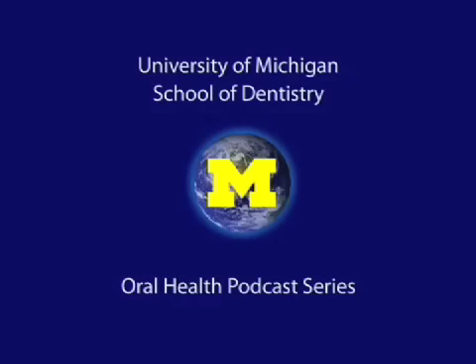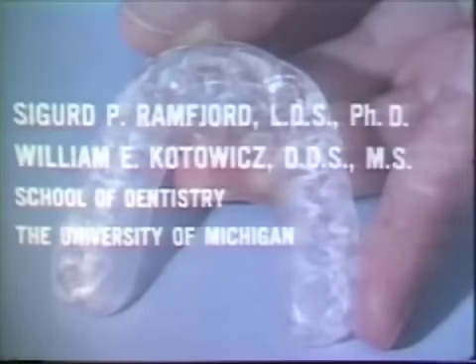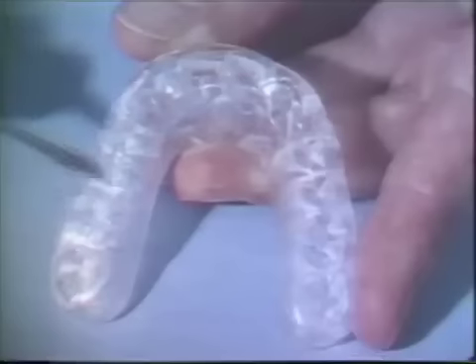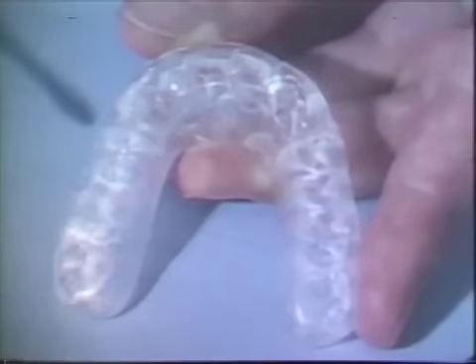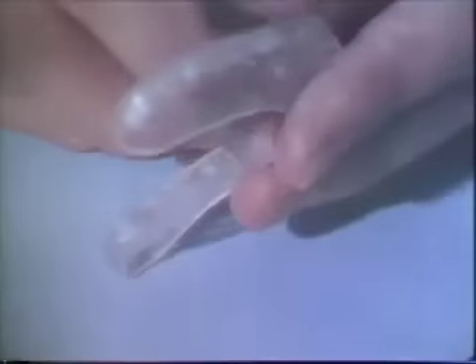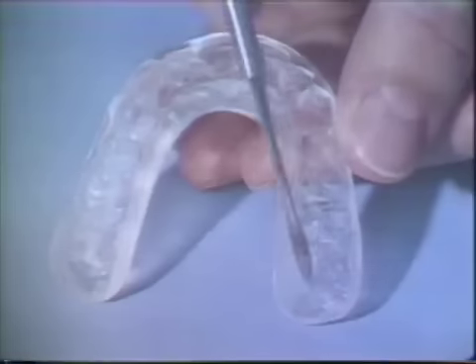Welcome to the University of Michigan Dentistry Podcast Series, promoting oral health care worldwide. The processed appliance should be inspected carefully for imperfections before it's tried in the mouth. The palatal side is inspected to be sure there are no artifacts that may interfere with the seating of the bite plane.